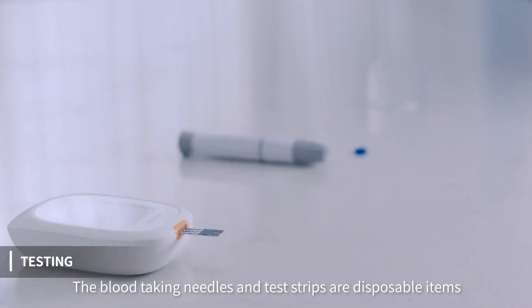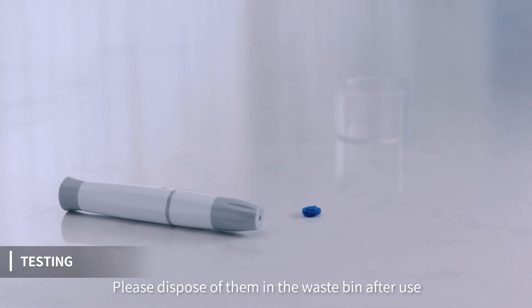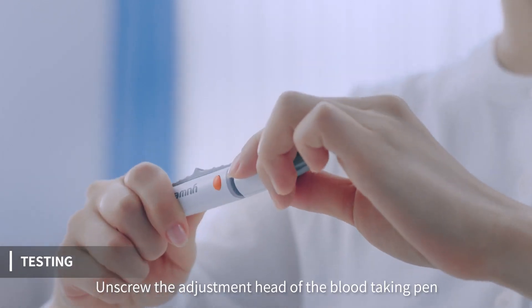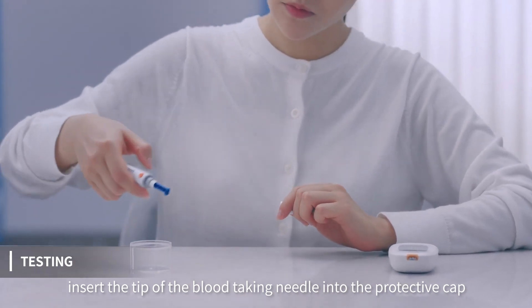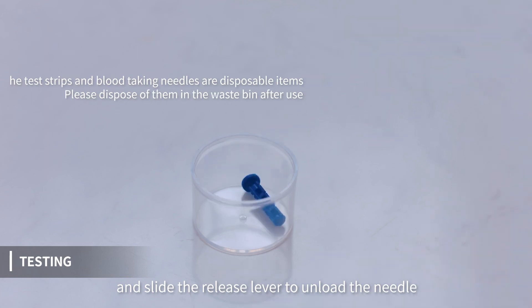The blood-taking needles and test strips are disposable items. Please dispose of them in the waste bin after use. Unscrew the adjustment head of the blood-taking pan, insert the tip of the blood-taking needle into the protective cap, and slide the release lever to unload the needle.